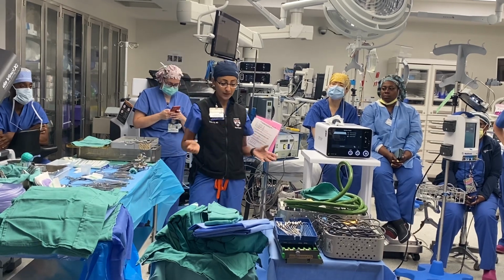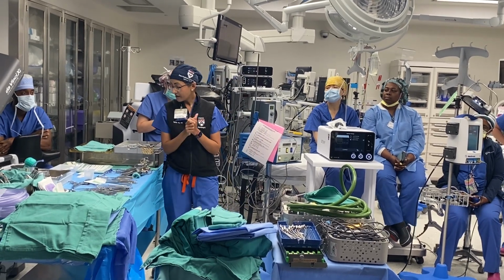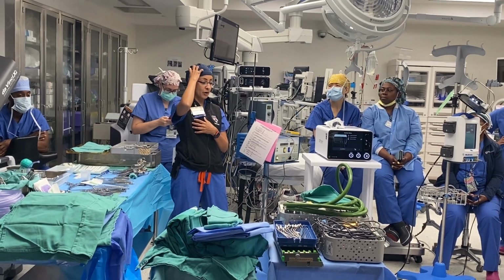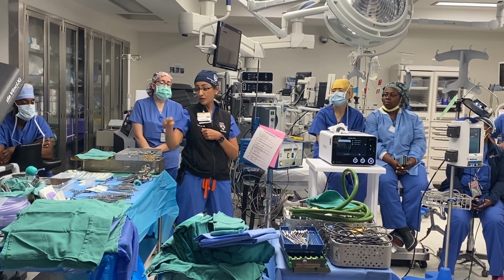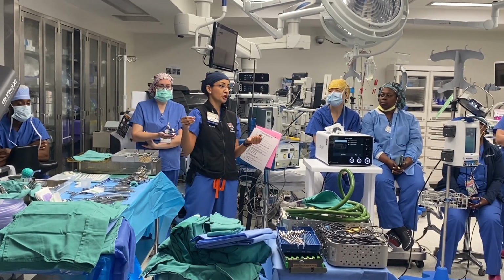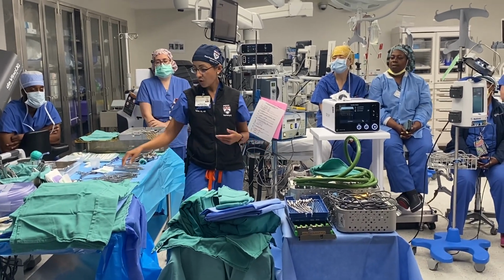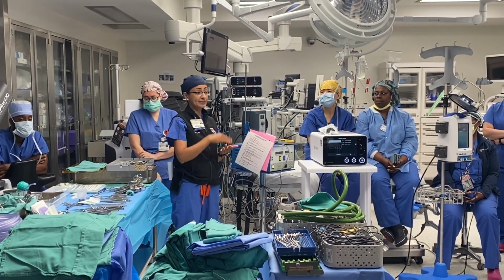Back to the head when we've opened, if let's say it's a tumor inside the brain, at this point I'm going to backtrack for a second because now I'm seeing all this stuff here and I'm like, oh, whoops, I forgot to go through that. Depending on where we need to take off the bone flap, there's a lot of good vascularity. We already talked about the vascularity of the scalp. That's why we use Raney clips to stop that bleeding. At the skull, the bone bleeds too, right? And so for the bone bleeding, we're going to use these balls of bone wax, and we'll all do it a little bit differently, sometimes on the back of a Penfield 4 or Freer, sometimes right in our hand, and we'll put it down. And then the other thing that bleeds is the actual dura.